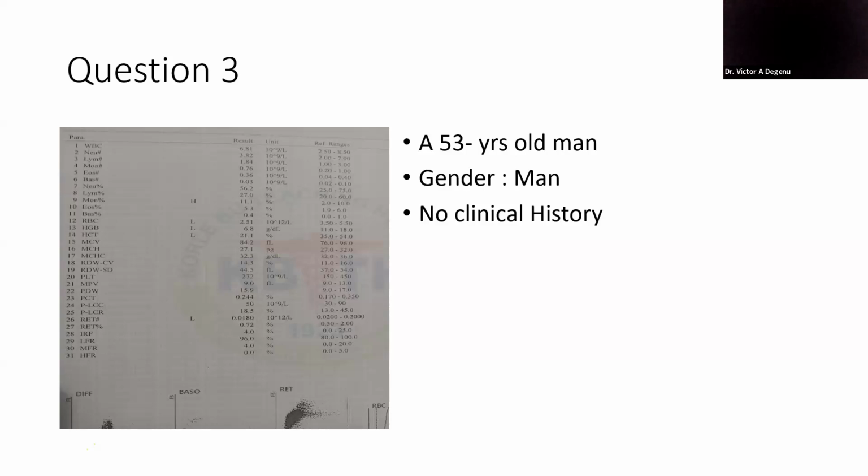So what do you say about this report? This is what came to you in your lab. You have no idea what is happening to the person, whether the person is on admission and they brought the sample, or the patient walked in for the sample to be taken. You did your full count, and these are the results before you. So what is your comment about it?